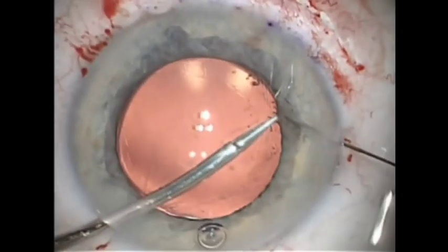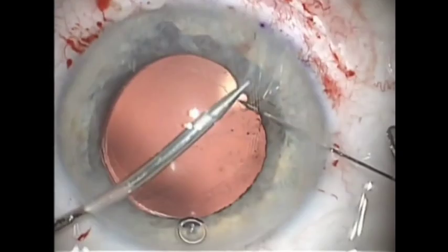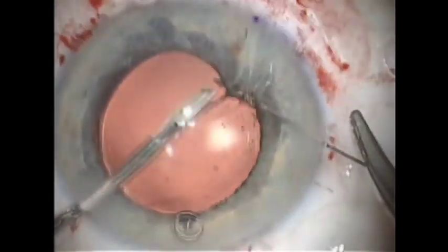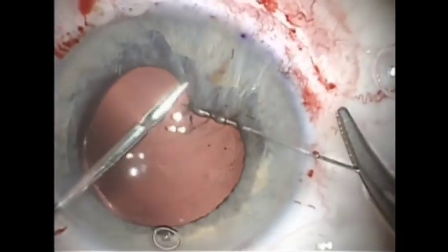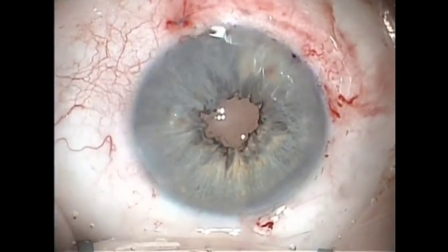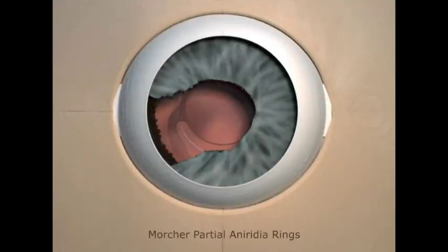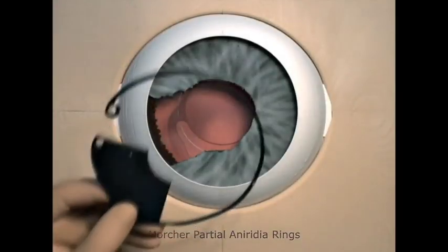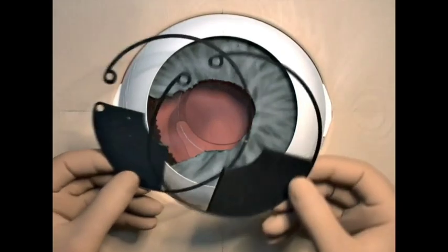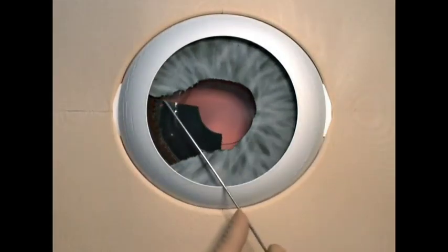Placing the sutures too peripherally, or if the iris is too atrophic combined with incautious manipulation with a needle with sharp edges, can lead to stretching out the tips of the iris, which has insignificant functional or cosmetic effect. More extensive partial defects of the iris with loss of tissue can be managed with aniridia rings that can be implanted either into the capsular bag or in the sulcus.